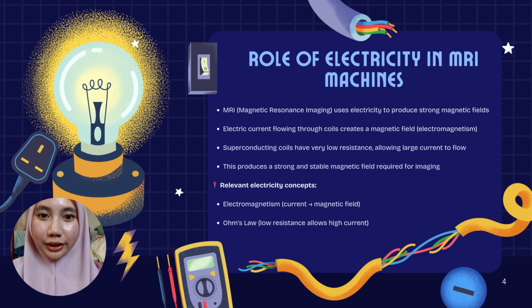For this slide, I will explain the role of electricity in the MRI machine. MRI stands for magnetic resonance imaging, and it uses electricity to generate a very strong magnetic field. This magnetic field is produced when an electric current flows through coils inside the MRI machine. This is based on the concept of electromagnetism, where an electric current produces a magnetic field.